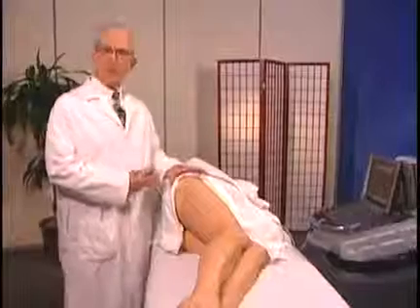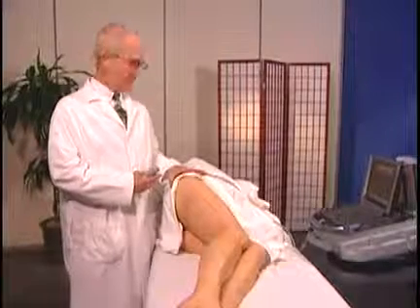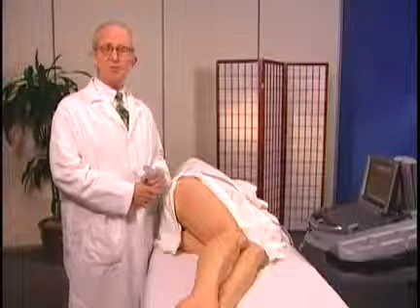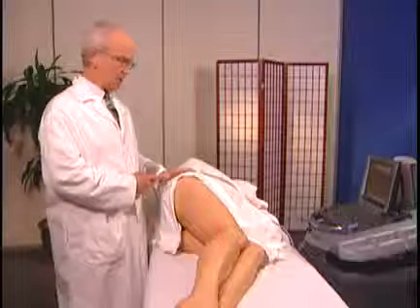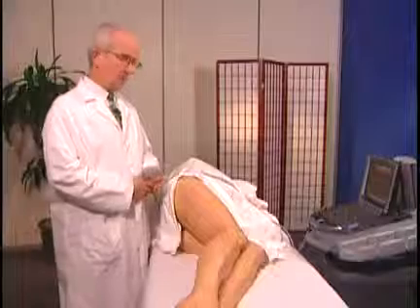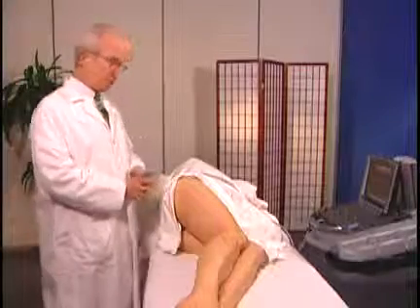I'm going to examine the lateral aspect of her hip, the greater trochanter especially. This would be an area that you can examine with ultrasound in a symptomatic patient. She's lying on her left side with her hip extended in just slight flexion position.